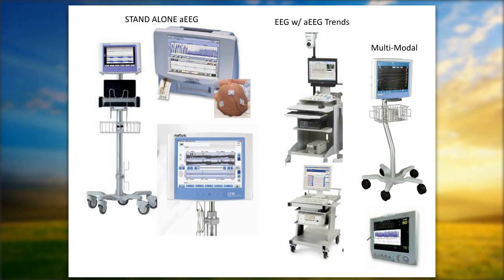The other nice thing is it saves space, because at one of my hospitals, we've mounted the NIRS device onto this device, so that when we have it at the bedside, it's just one device instead of two. So again, I think we're moving towards this ability to see many trends in one. So it's important to think about your internet access, your space issues, who's going to be using it, and the frequency you're going to be using it, to decide which of these is right for you.